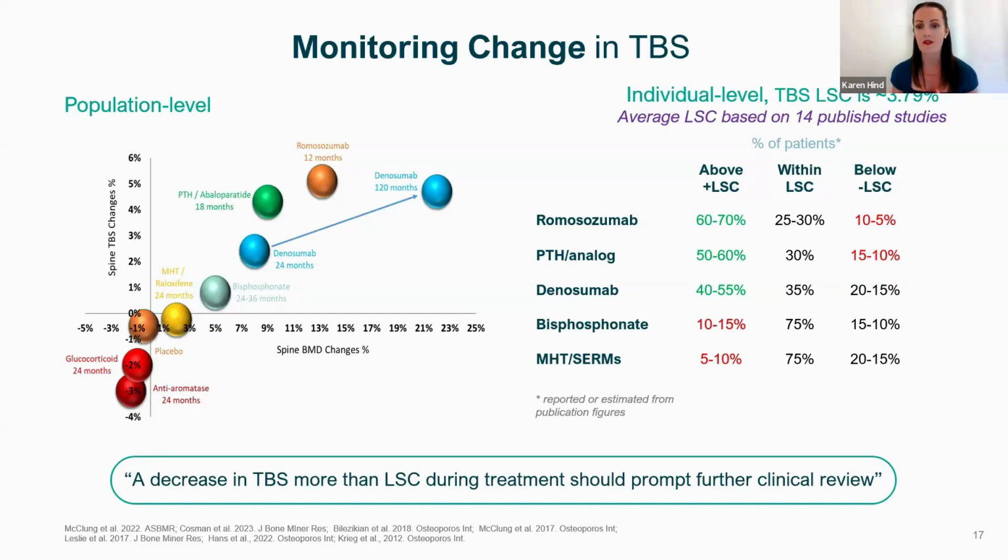We'd expect to see no change given the treatment mechanisms of action. And that's always important to consider when you're looking at the BMD and you're looking at the TBS, which treatments are going to be most beneficial for your patients based on the knowledge of the mechanisms of action of that particular treatment and the overall skeletal profile of your patient.